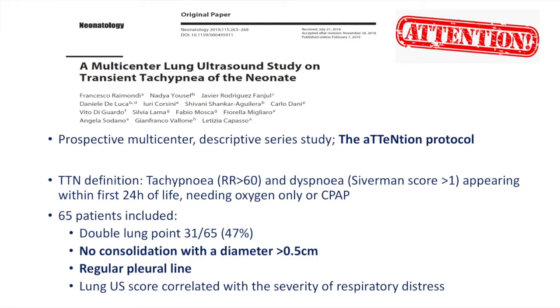Double lung point has been studied in a prospective study including newborns admitted to the neonatal unit for respiratory distress diagnosed as TTN. This is the attention protocol. What the authors found is that they found the double lung point in 47% of their cases only.